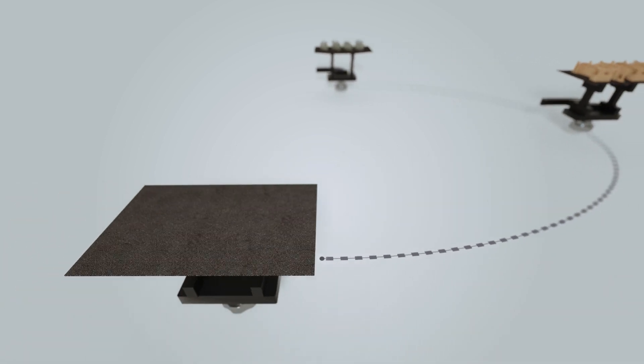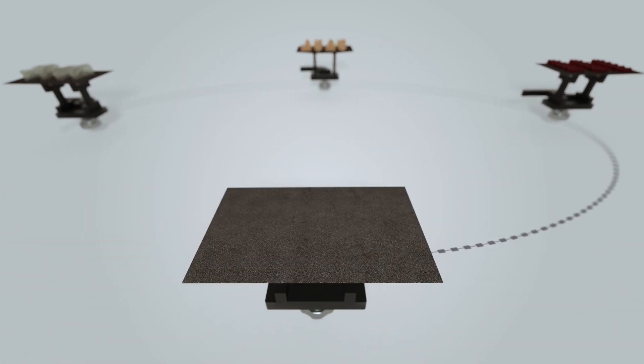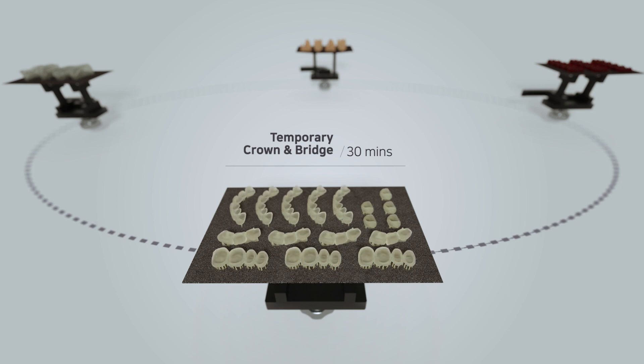These casting models are free from any residue and cover every casting case, like partial frame, metal crown, and device or orthodontic. You can always create different designs of crown and bridge within an hour. Compare the best design and fitability without a remake process.